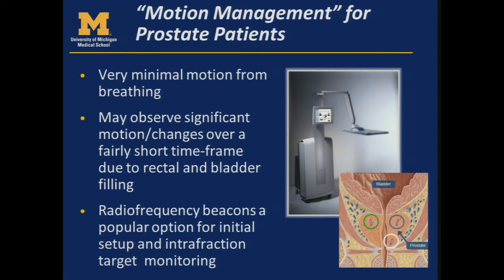And so I think that's one of the reasons that RF tracking is very popular for these types of patients, because you are getting real-time information on those changes, especially as we're treating to smaller and smaller margins. This is really important if you're trying to treat with, say, a 1 or 2 millimeter margin.